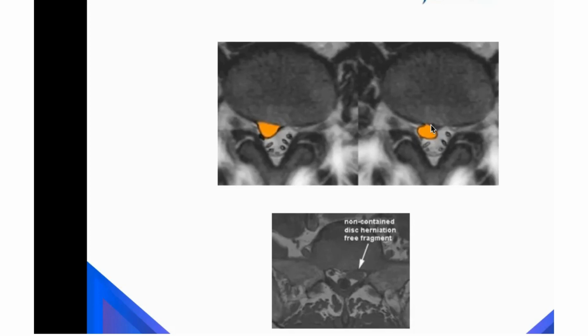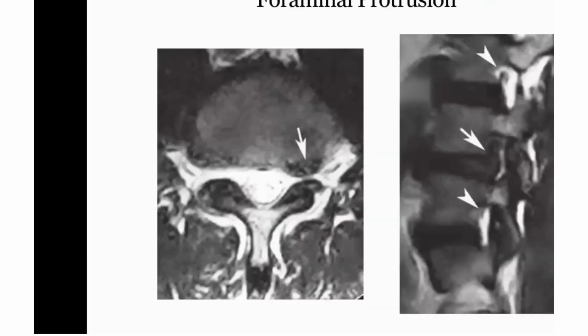Dr. Sojana is going to take a lecture on these pathologies and the terminologies, what terminology we should use. So look at this, I'll show you some examples.